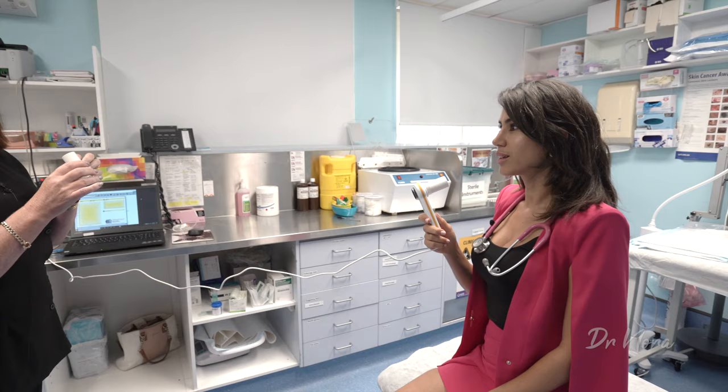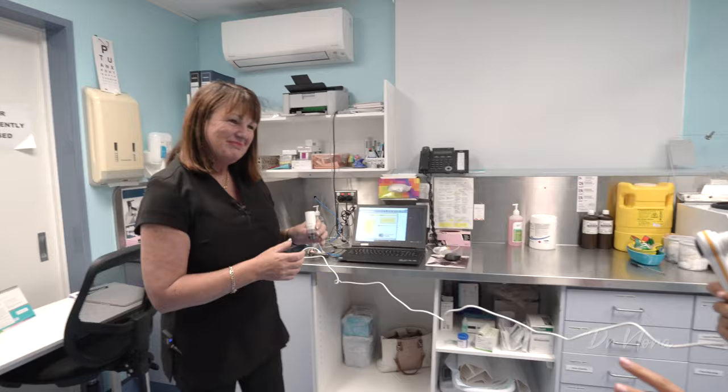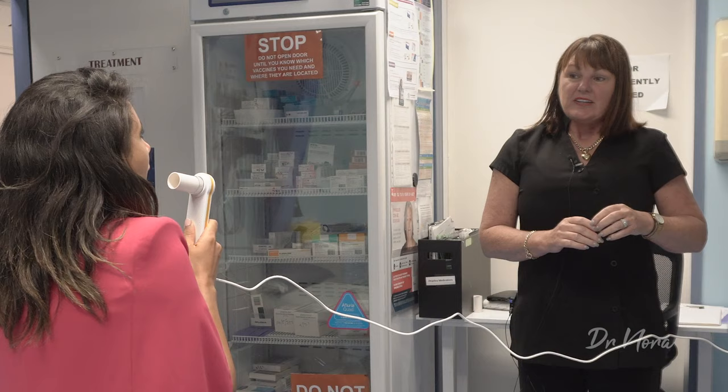How bossy am I? I'm quite nervous, you know, guys. So a really deep breath in, seal your lips and blow until I say stop. Blow as hard and as fast as I can. Very hard. Okay. Let's go. Let's do this. All right. So big breath in and go.